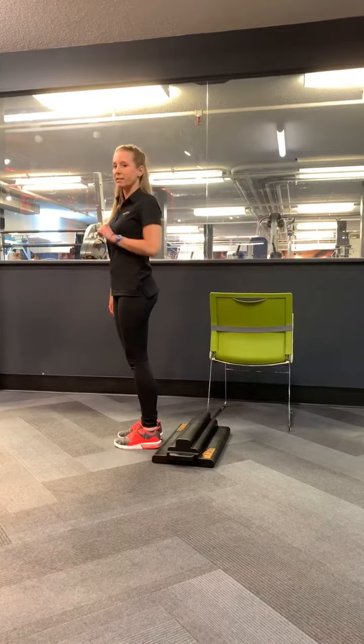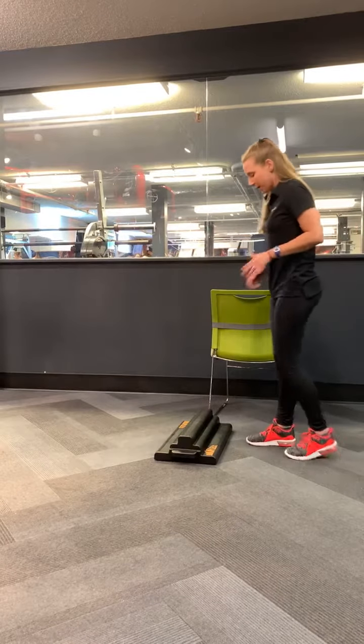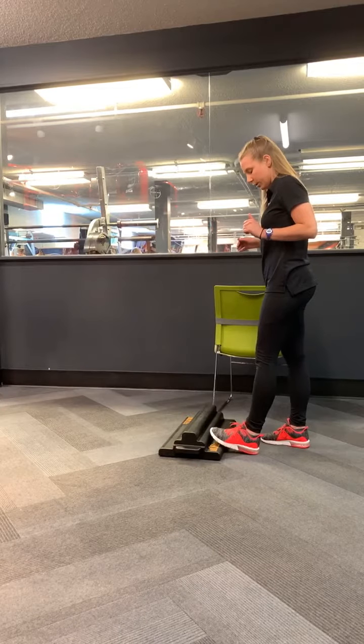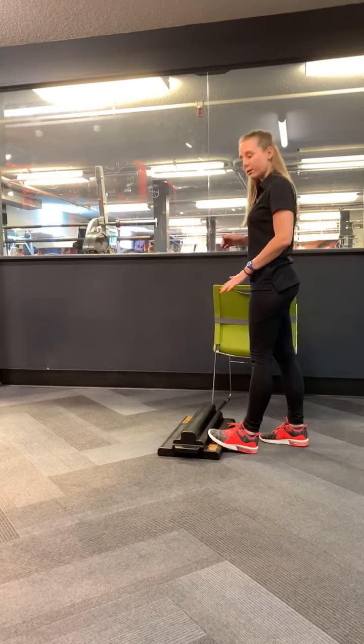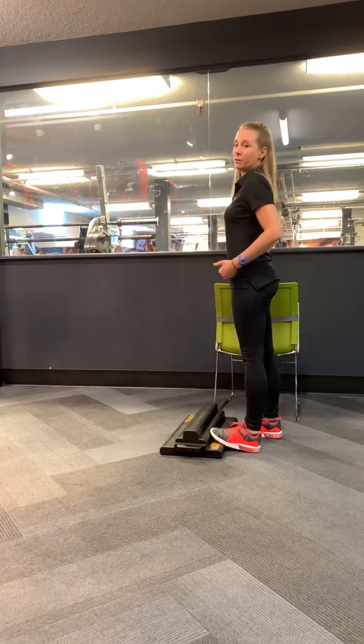So those are your 5 phases of gait. And we will repeat on the other foot. So now we have our left foot that's going to be the stationary one. So you're going to strike the ground with your heel, placing the balls of your feet on that first tier, and then bringing that right foot just in contact with the ground behind the Moflex.